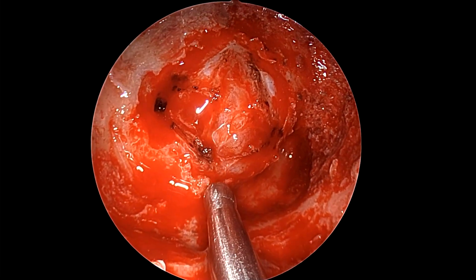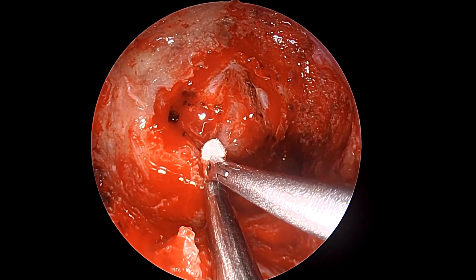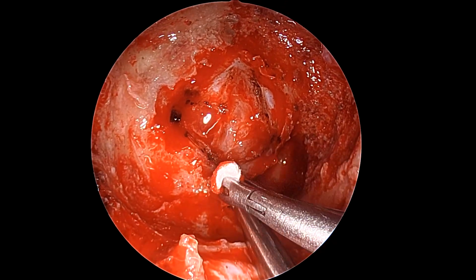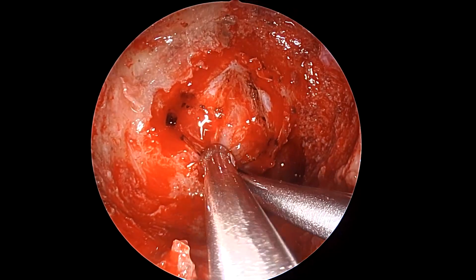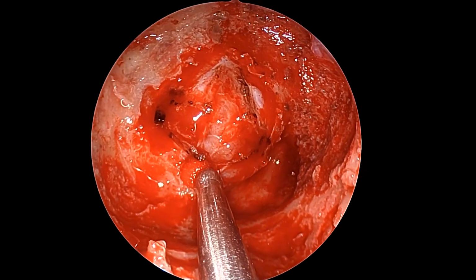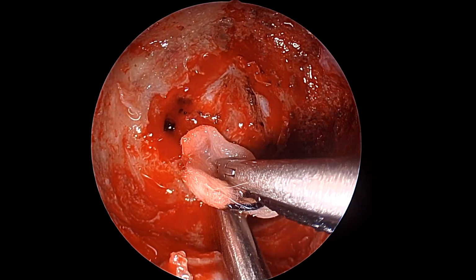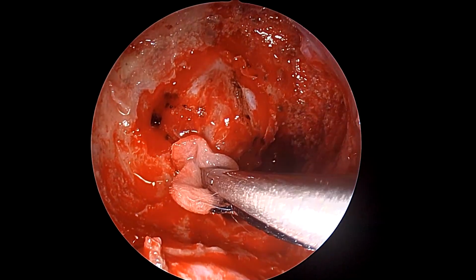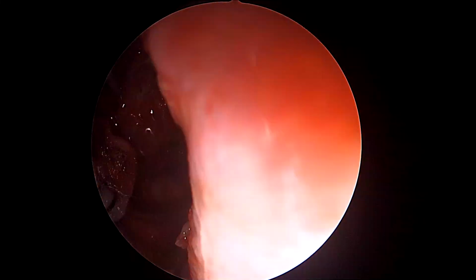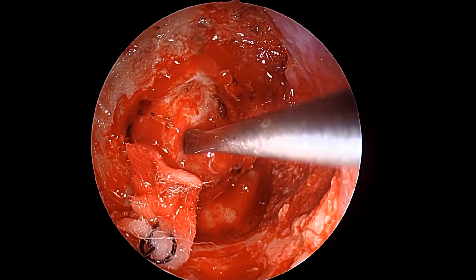sometimes once you are inside the sellar, inside the tumor, even these small issues of ooze can rather frustrate you by causing repeated bleeding inside this area, and obstructing the field of vision, wasting time. So it's a good idea to keep managing any more than usual ooze that you see in the surgical field before you come to the most important part of the surgery, which is going inside the tumor.